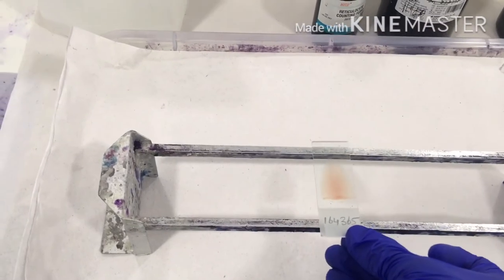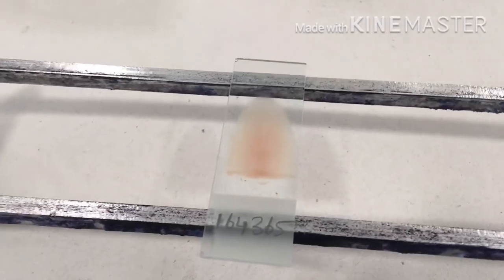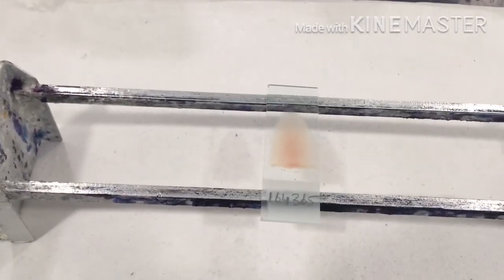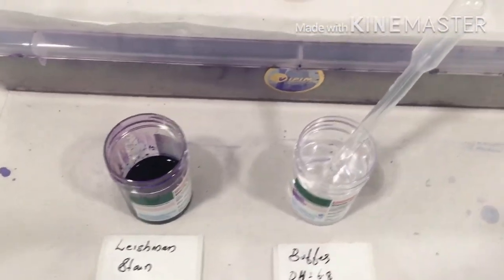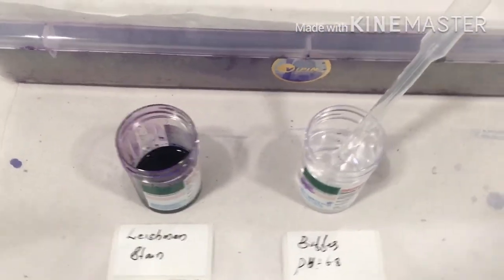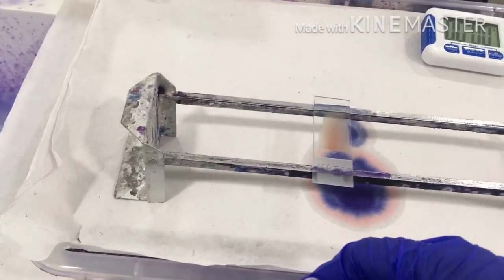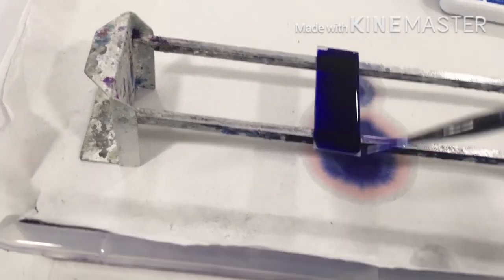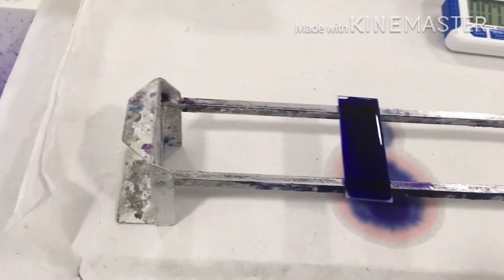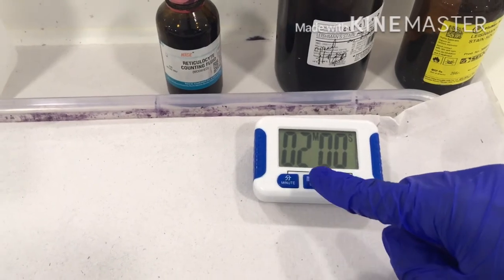So the smear which we have made is dried. Always we have to keep the smear on a plain surface, simply because otherwise when we add the stain, it may go out of the smear. Approximately 8 drops of stain we have to add, but if we can cover the smear with the stain, that's perfect. After adding the Leishman stain, we have to wait for 2 minutes.